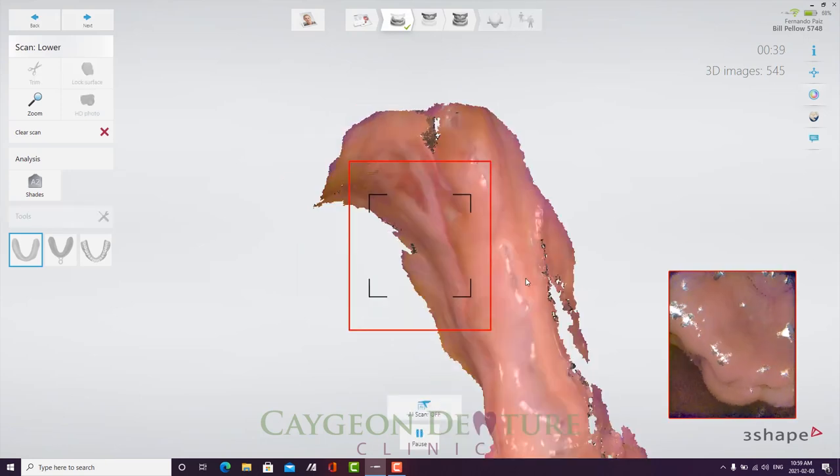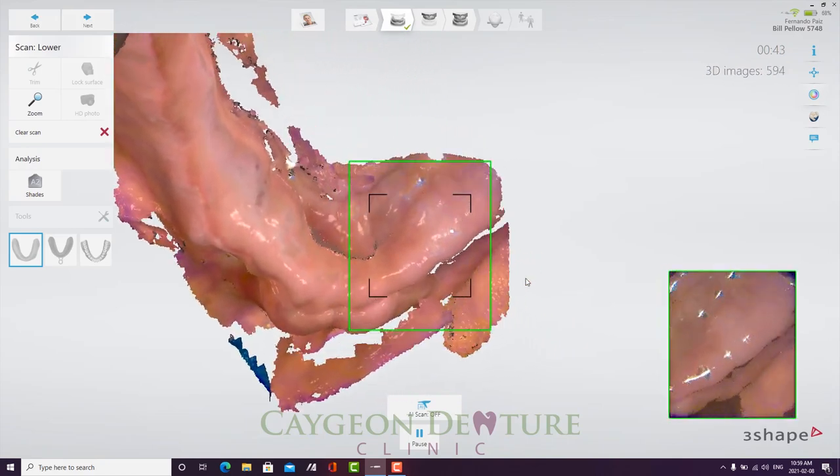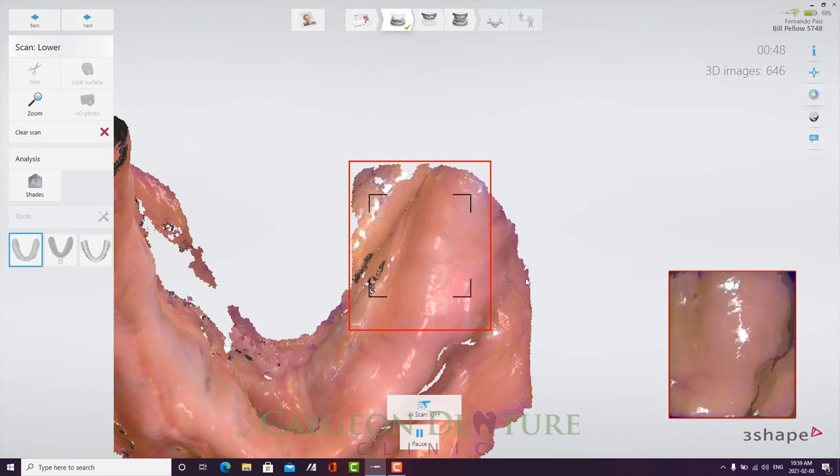So following Dr. LaRusso's workflow, I scan one half of the mouth, let the patient relax and let the software do its thing, or finalize the scan. And then I go ahead and scan the other half of the mouth.